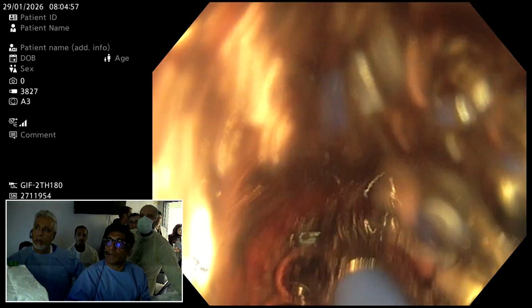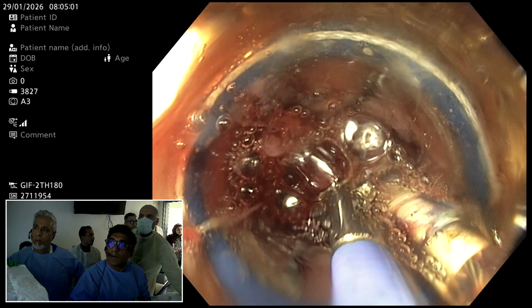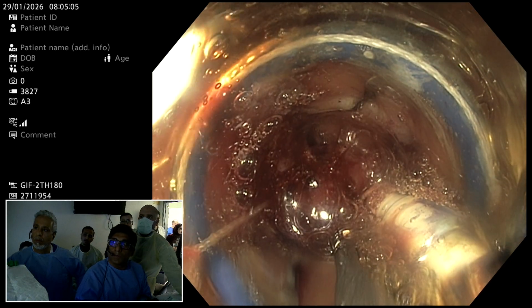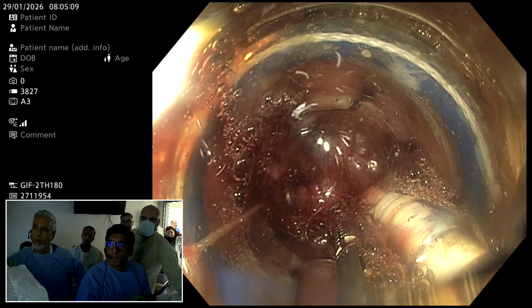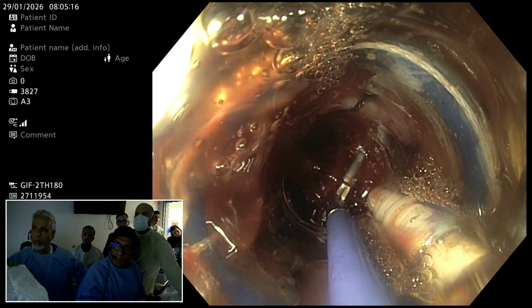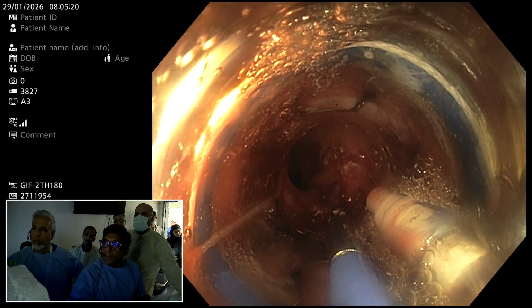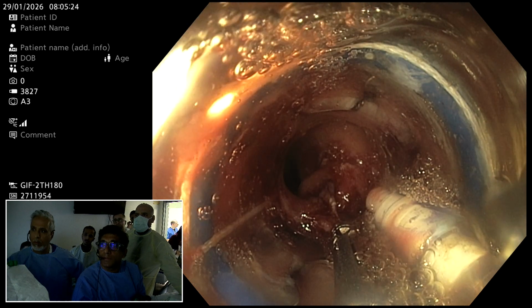Okay, go ahead. Give me 1 minute, please. Close. Open. So I'm trying to grab this. Close. And then bring. It's quite a hard tumor there. So I have to use some suction.